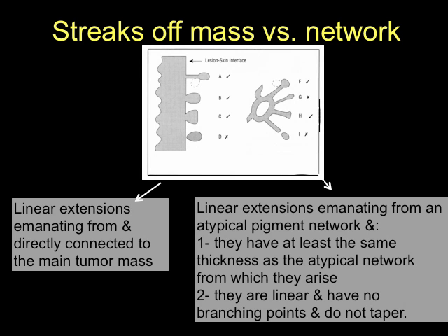Lines coming off a network are considered streaks if they have at least the same thickness as the atypical network from which they arise, are linear with no branching points, and do not taper and fade as they progress towards the periphery. Line G is not a streak because it is thinner than the network from which it originates. Line I represents a peripheral globule, the significance of which will be discussed shortly.